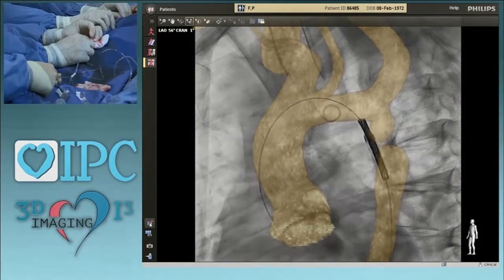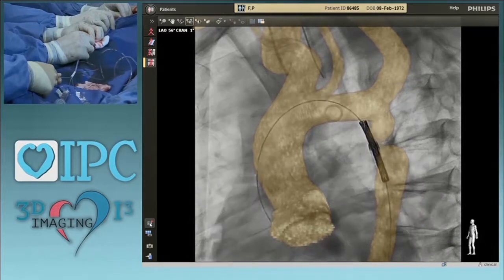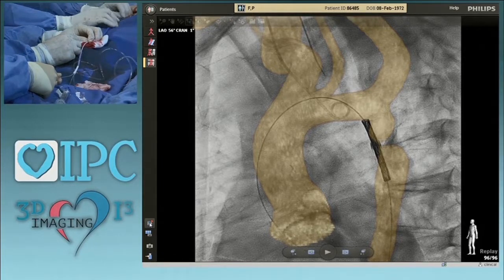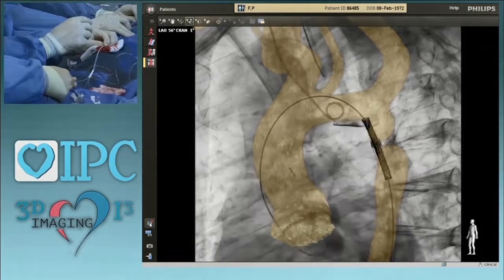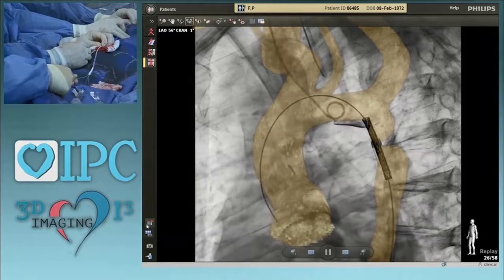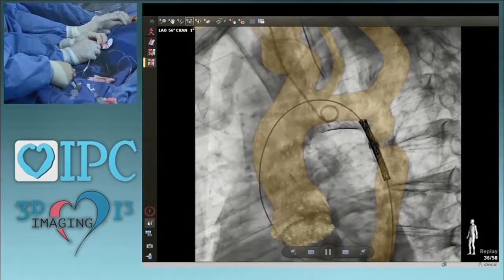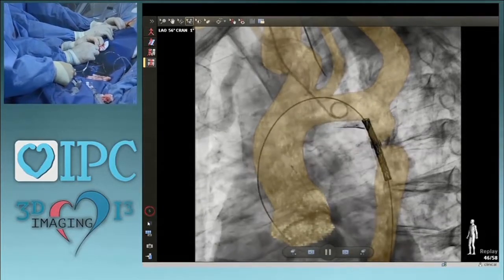Gianfranco, Gabriele speaking. Do you always perform a circuit, even if CT showed that it wasn't a complete atresia? Yes, that's our preference, to do a circuit. Yeah, we do prefer to have a circuit because when we have to pass with a big sheath, even a 12 French sheath, it's better to have some tension on the system. Otherwise, we need to. Okay, if you don't mind, just let us see without any question now.